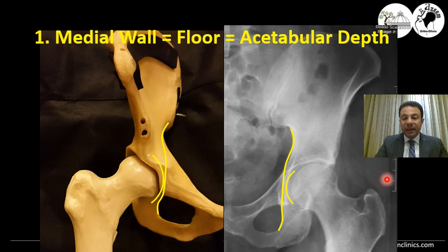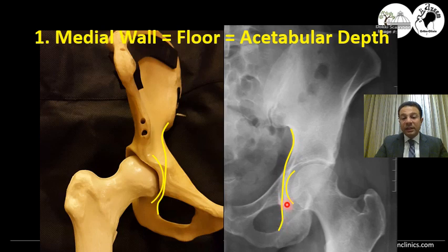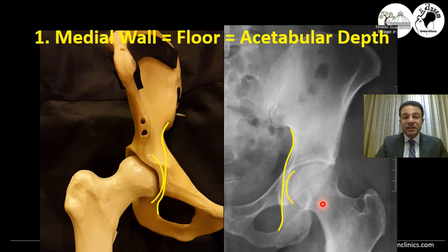This line, anatomically, should be slightly lateral to what we name the posterior column line or the ilio-ischial line. So it should not be touching it or medially protruding over it. That's the medial wall line, and it delineates or shows how much depth the acetabulum has.